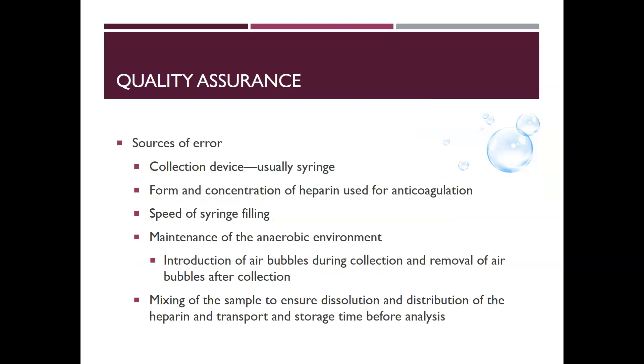Sources of error include the collection device — any problem with the syringe is a potential error. The form and concentration of heparin used for anticoagulation is also a source of error if the blood-to-heparin ratio is off. The speed of syringe filling matters — if filling is difficult, clotting may occur. Maintaining an anaerobic environment by expelling air bubbles is important, as introducing air bubbles during collection is problematic. Finally, proper mixing to ensure dissolution and distribution of heparin, and transport and storage time before analysis, are all sources of error to be mindful of when performing blood gases.